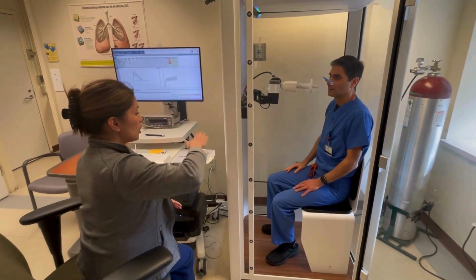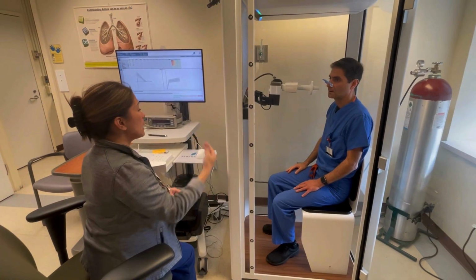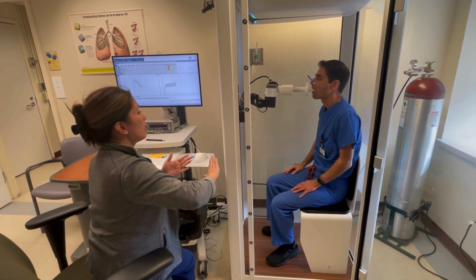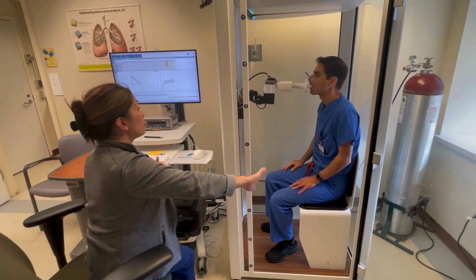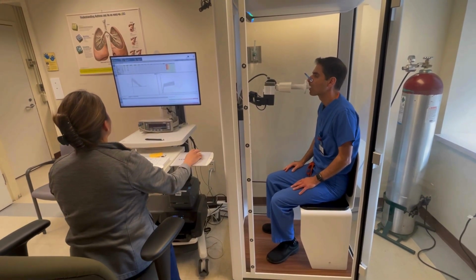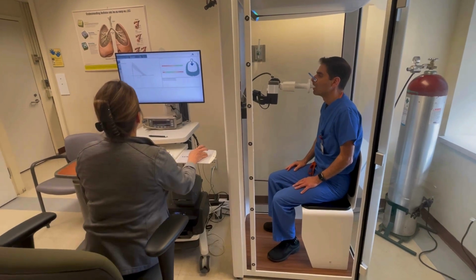So you're going to pinch your nose, breathe normal on the mouthpiece. I'll tell you to take a big breath in nice and deep, and you're going to blast your air out, pushing all that air in one breath. And then I'll tell you to bring your breath back in and you can disconnect. So go ahead and breathe normal here first.